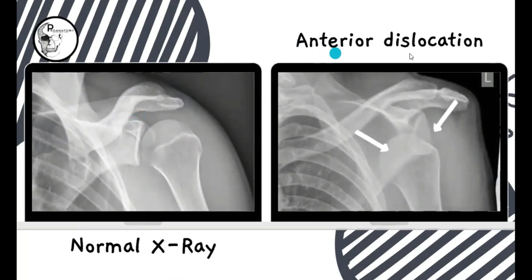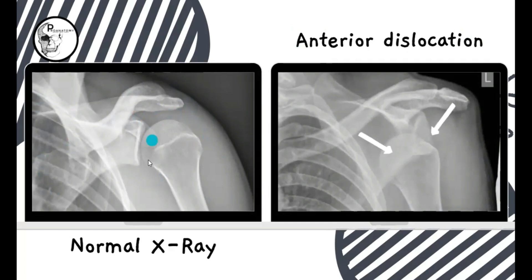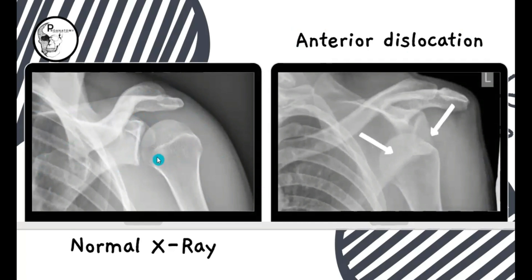First, anterior dislocation. On the left side we have a normal X-ray of the shoulder joint with the head of the humerus and the glenoid cavity of the scapula closely approximated to each other — this articulation is the shoulder joint. You can also make out the outer margin of the soft tissue, which is somewhat convex in shape.